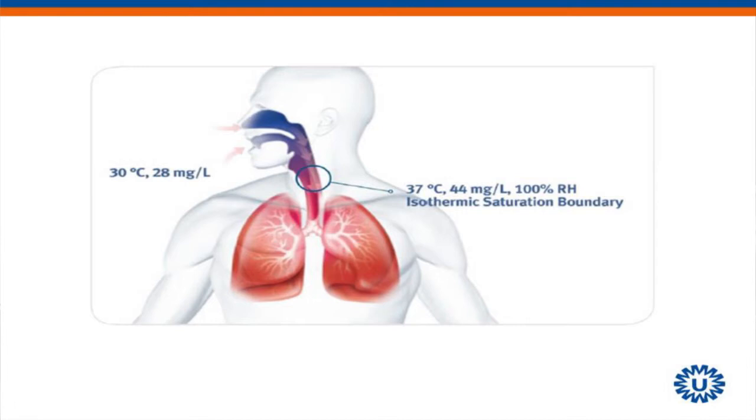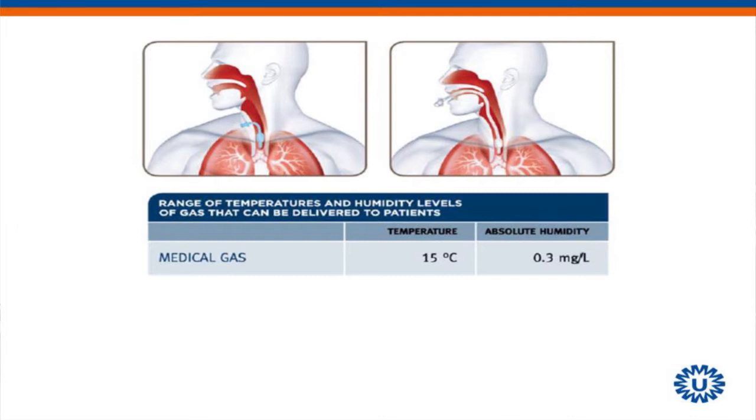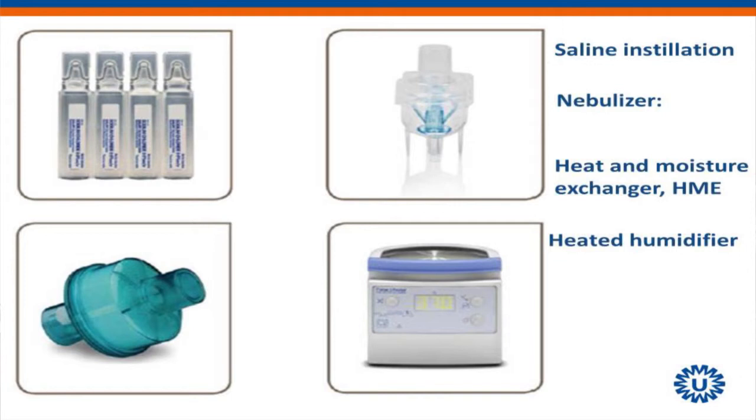But there are more ways to humidificate your patient. Sometimes, it's not my idea, but sometimes one of these are used. Sometimes there's installing a saline. Who is installing saline? Nobody. Who is using aerosols? For medication or for humidification? Yes, but I mean for humidification. And something in adults is really common.